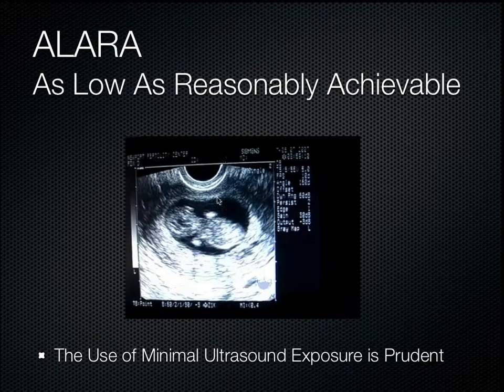Oh, no, probably less, actually. We're using the endovaginal probe here. This looks like he's probably about 9 weeks or so.